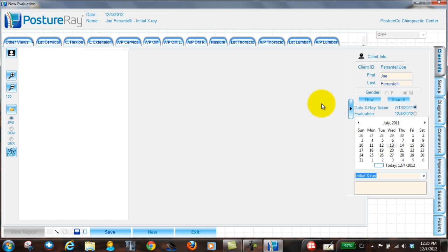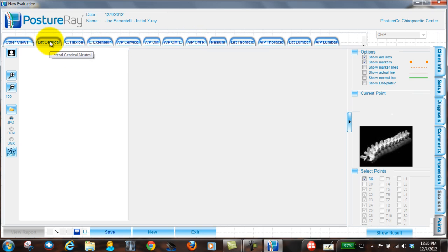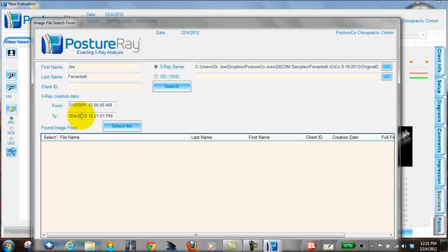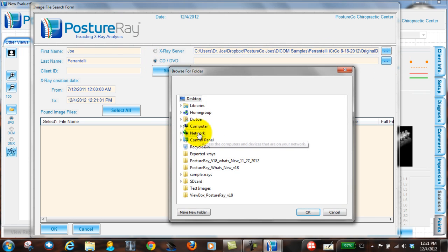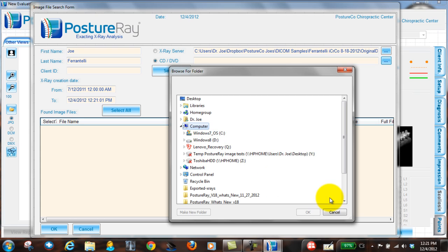So with that being said, we must, across the top, choose at least one X-ray that we know is in that series. So I'm going to choose the lateral cervical. Then I'm going to come down to this DCM browse with the glasses. When I open up this DCM browse, you have the patient's name up here, first and last name, the date range. Notice with the date range, it selected a date before that we did to current. This is the X-ray server path that I have.